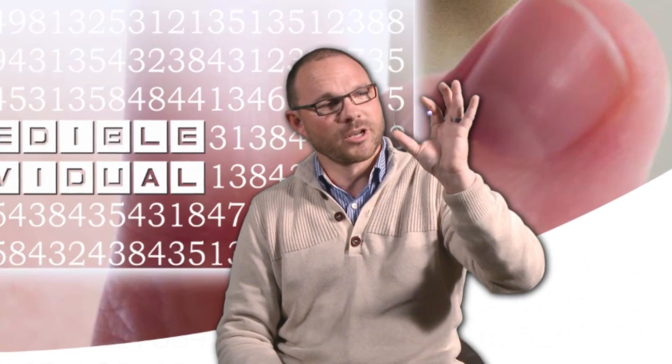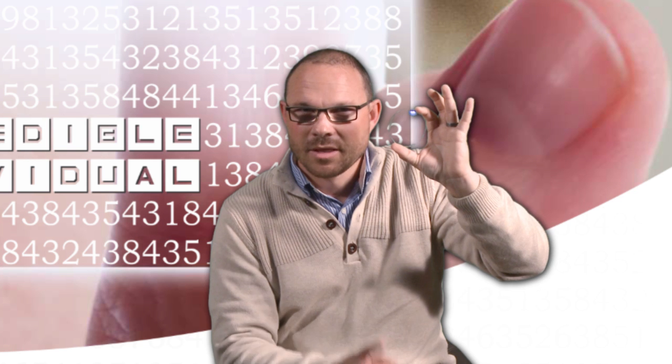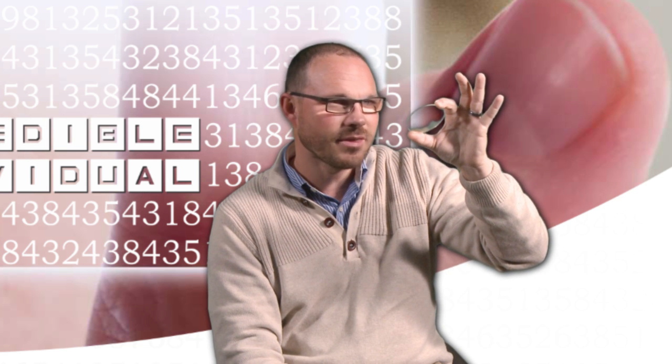In my hand, and I'm going to tilt it a little bit, I'm holding an ordinary single vision lens. Now, to look through a single vision lens is quite a simple optical system. When I look through this, everything is quite clear. But the moment I start tilting this lens forward, suddenly everything behind it starts to distort, not as clear anymore. The same thing will happen if I tilt this lens the opposite direction, maybe around the vertical axis. And again, everything starts to distort.